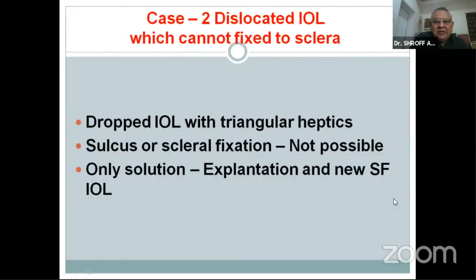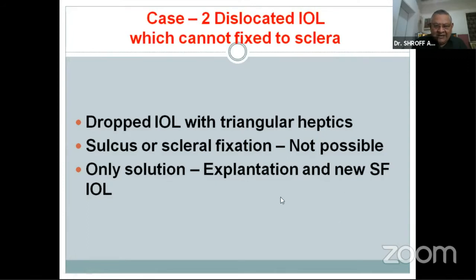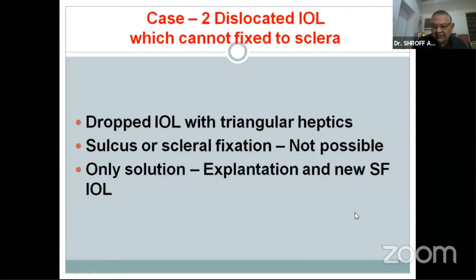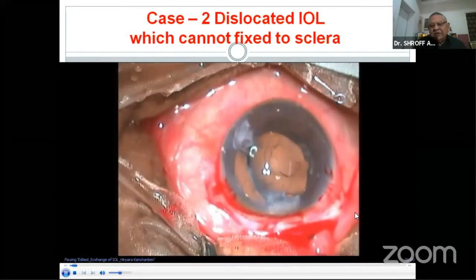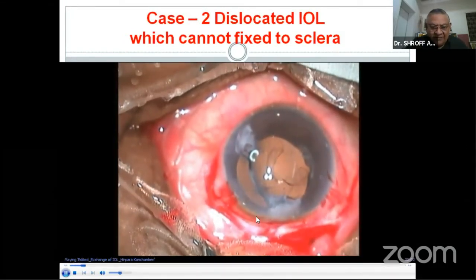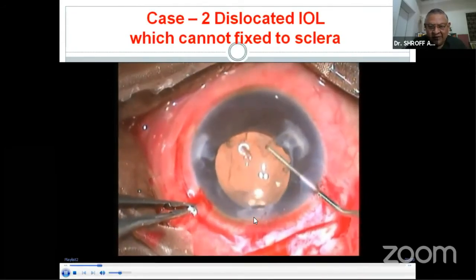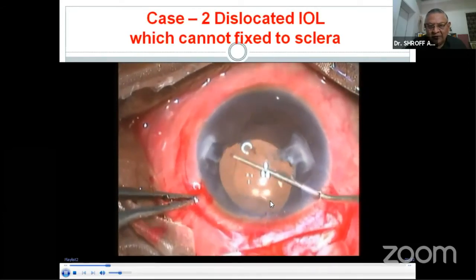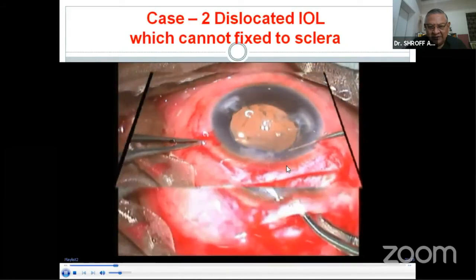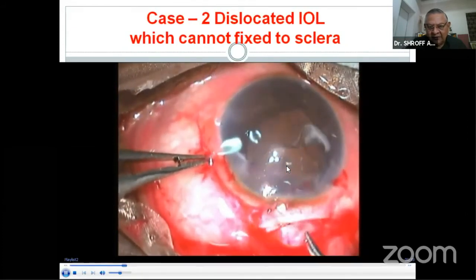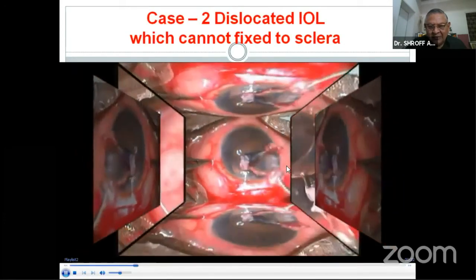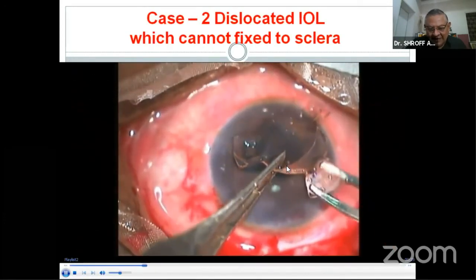When a lens is dislocated with improper haptics and cannot be repositioned with adequate support, simply explant it and put a new IOL fixed to the sclera. Different methods are available — glued IOL, Yamane technique with many modifications. Taking a lens with triangular haptics out into the anterior chamber: the capsular bag was also dislocated. It is difficult to fix the same lens to the sclera, so it must be taken out.